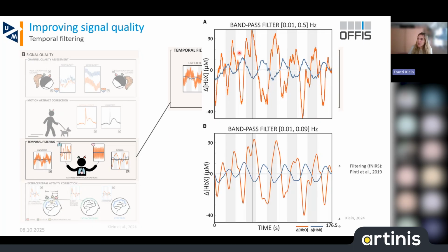And here, of course, you see it's a bit more noisy because the cutoff is much higher, so we keep more high-frequency parts. And this one is much smoother. But what you can see here is that we also have a slight delay. So this peak here comes later than this peak. And this is because of the frequency. So it's a bit frequency dependent.